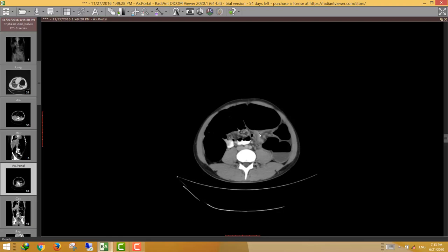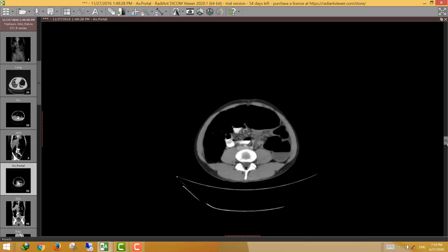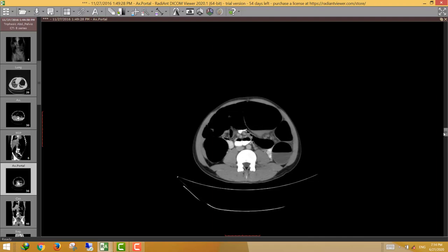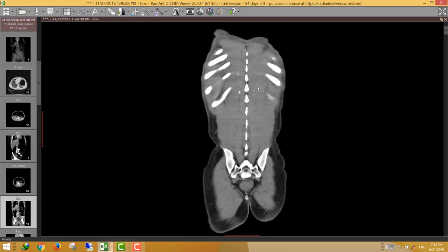Such a pattern of obstruction is usually caused by three things: adhesion or adhesive band (requiring history of prior surgery), internal hernia, or volvulus. To diagnose volvulus, search the mesenteric fat planes for the characteristic whirlpool sign.